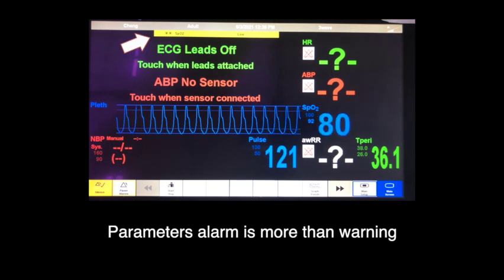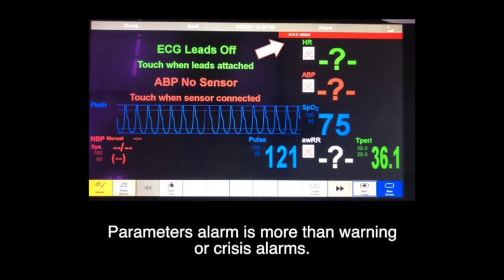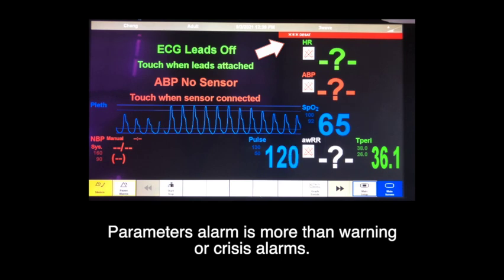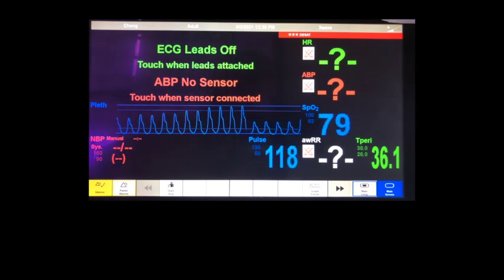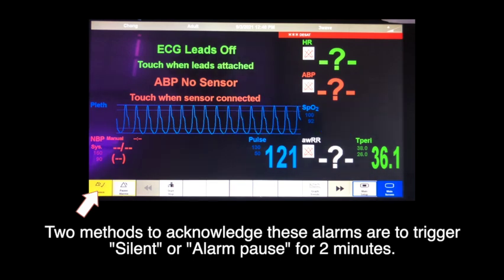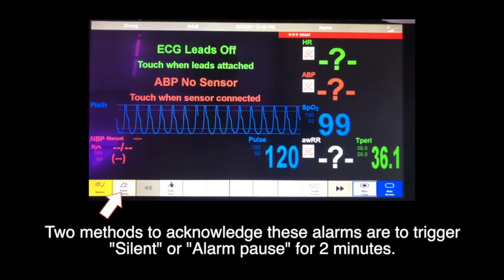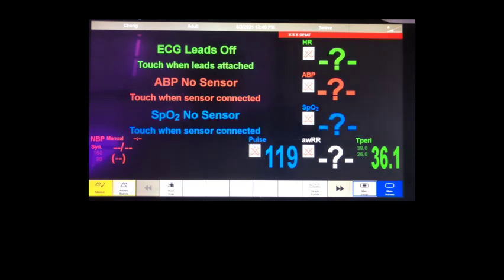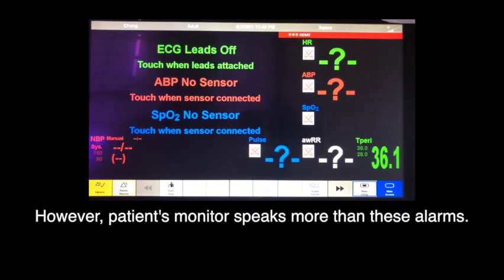Parameter alarms are more than just warning or crisis alarms. Two methods to acknowledge these alarms are to trigger silence or alarm pause for 2 minutes. However, a patient's monitor speaks more than just these alarms.